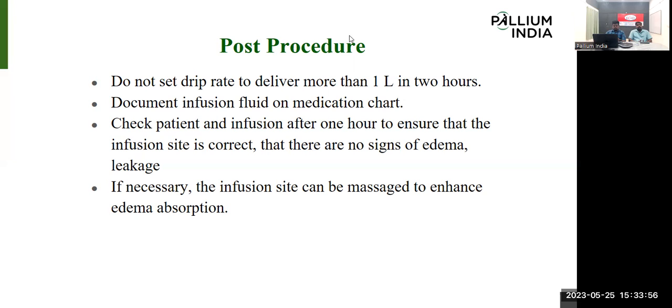What are all the things we need to check? Whether there are any signs of edema or any leakage. Mild edema is normal only. But if the edema is not subsiding or is increasing, it's a problem. Leakage means we can assume there is poor fluid absorption in that area, so we cannot continue. These are all the things we need to assess 1 hour after starting the infusion.